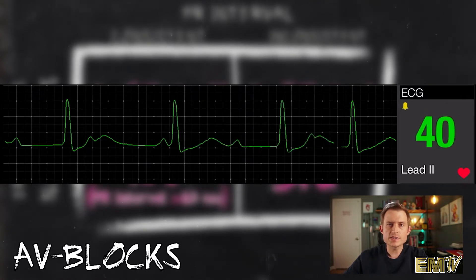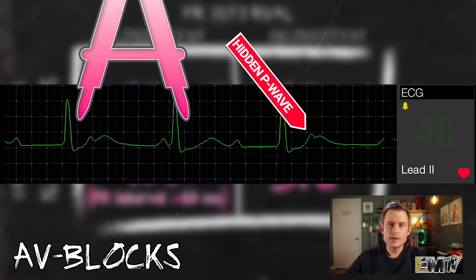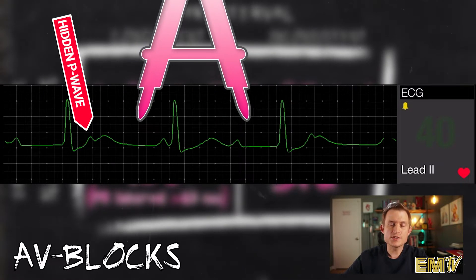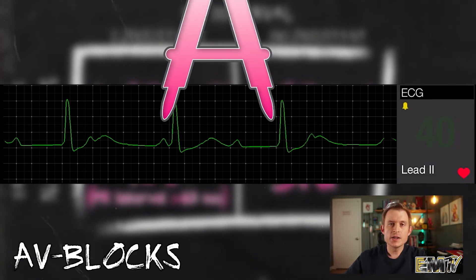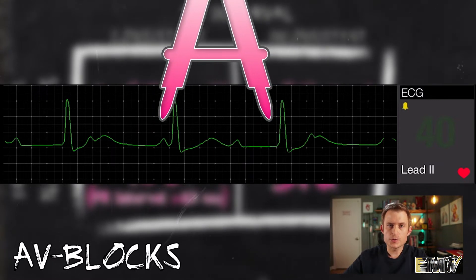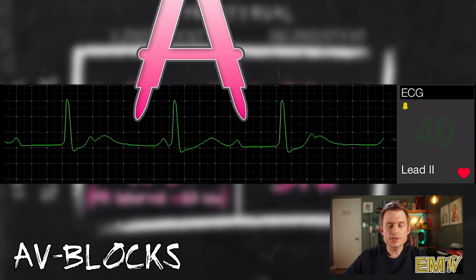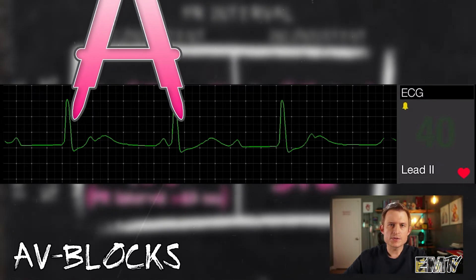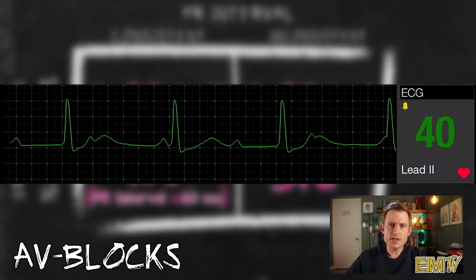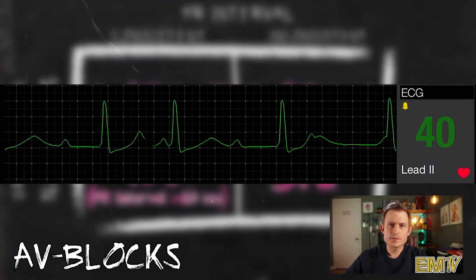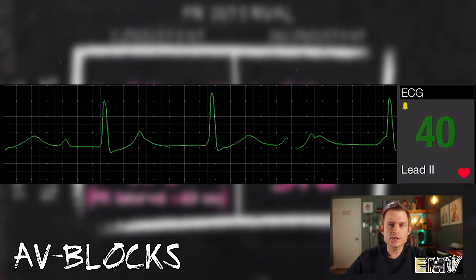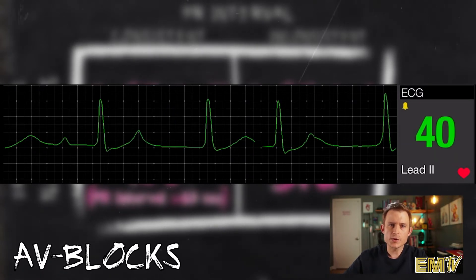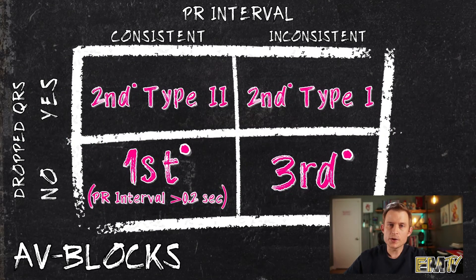The R-to-R Interval is completely consistent, because if you think about what third degree heart block is physiologically, it's a complete dissociation between the atria and the Purkinje fibers of the ventricle. The AV node is not functional in this rhythm and cannot communicate an electrical signal from the pacemaker site of the SA node, which is in the atria, into the ventricles. So each portion of the heart's conductive system is working independently, and that's why the P waves do not line up with the QRS complexes or may be buried within them.